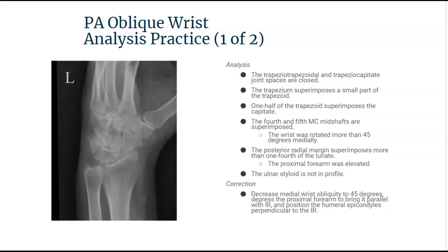Also, the posterior radial margin superimposes more than one-fourth of the lunate. This should let you know that the proximal forearm may have been elevated a little bit — it's not parallel with the IR like it should be. Everything should be parallel. And the ulnar styloid is not in profile. So we have excessive obliquity with a little bit of elevation from the proximal forearm. In order to correct this imaging error, we need to decrease that medial wrist obliquity to 45 degrees, make sure that the proximal forearm is parallel with the IR, and position the humeral epicondyle perpendicular to the IR.